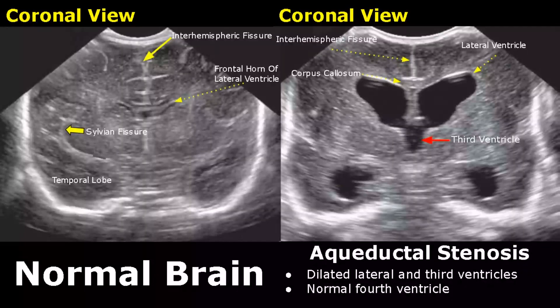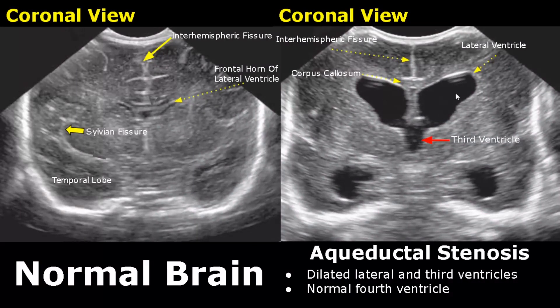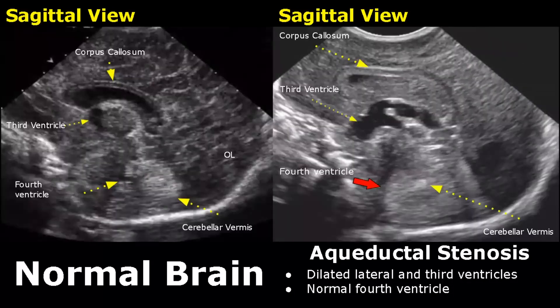In aqueductal stenosis, the lateral and third ventricles are dilated but the fourth ventricle is normal. This sagittal view shows a dilated third ventricle and the fourth ventricle is normal.